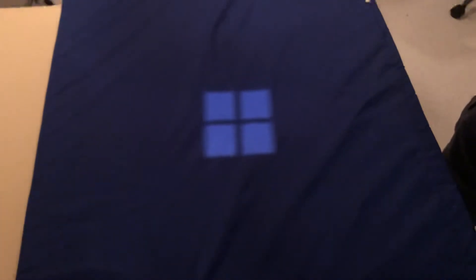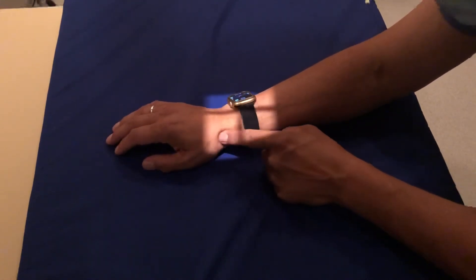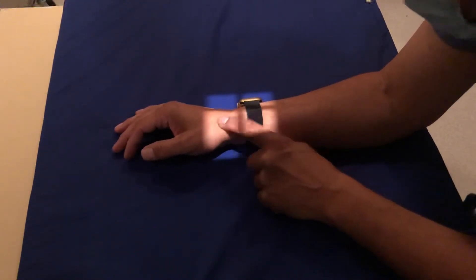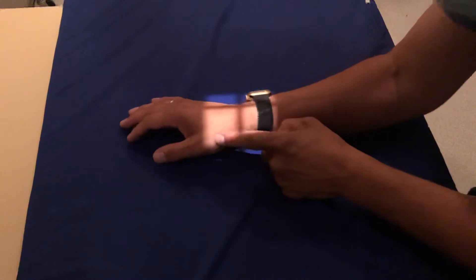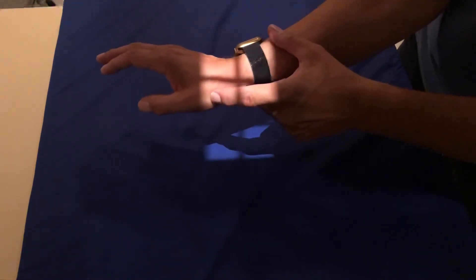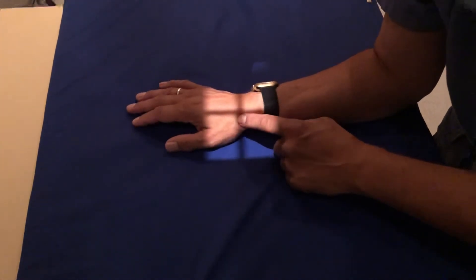For the last view, we're going to put an angle on the tube of 15 degrees and bring it over here. They call this the snuff box, which is right here — it's a soft depression more on the radial side than on top. We all have one. Just bring your finger down the side of your thumb right here and you'll feel a little depression. That's where you want to center.